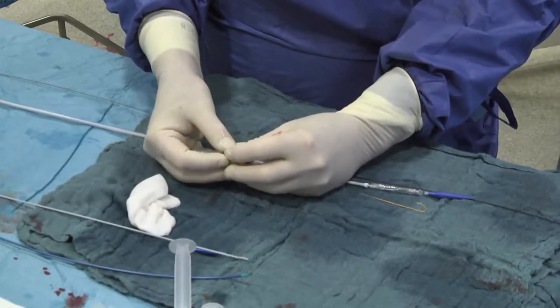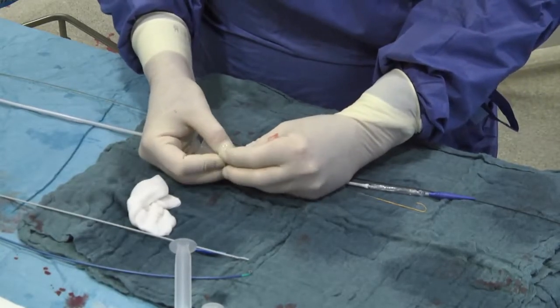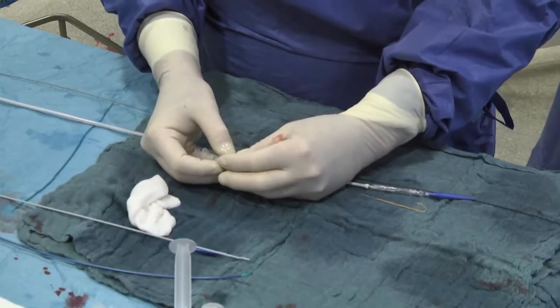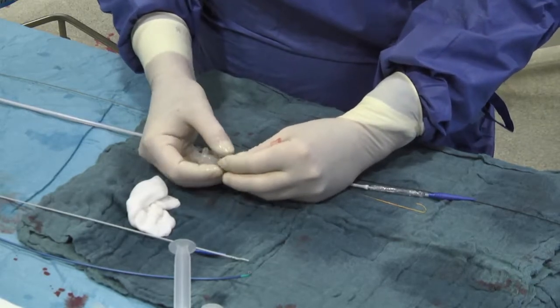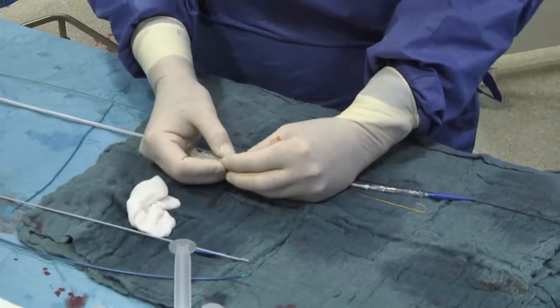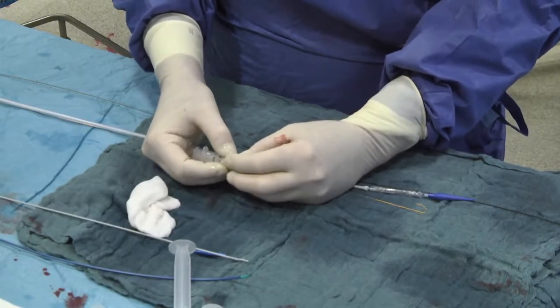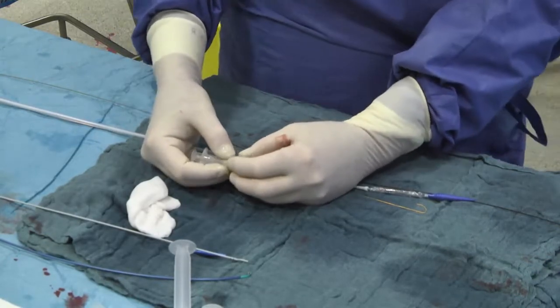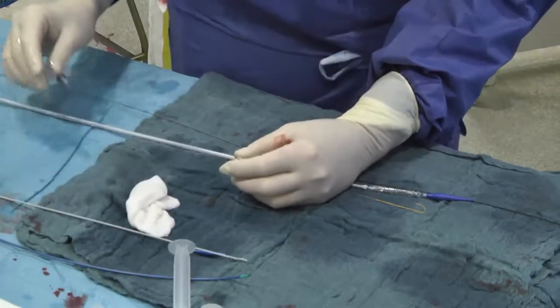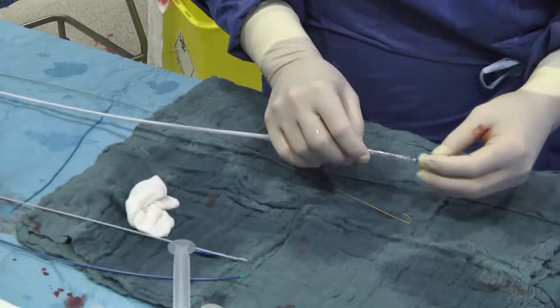Let me ask you a question. I mean, you prefer to do this rather than use a straightforward Edwards valve, 26 millimeter? Well, both valves have their advantages and disadvantages. The Sapien would be 26 straightforward. The problem, as you already pointed out, was that you may have to open up the stent as you come in, because, as you know, you will enter the pre-stent with the Sapien valve unprotected. It may encroach to the stent, and that may be a problem.